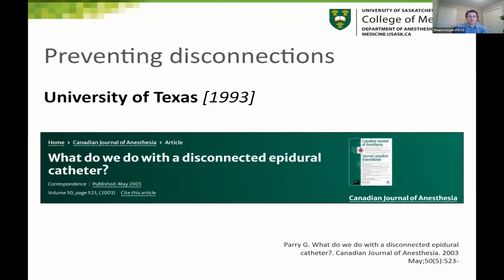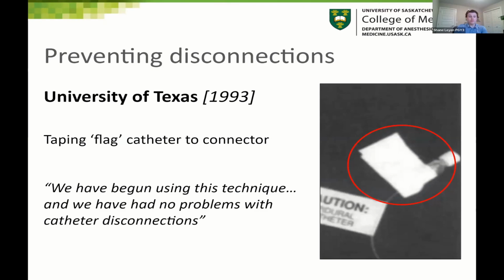This is out of Texas, but published in the CJA, and something a lot of us have probably heard of is simply taping the flag to the connector. They did not give stats, but they said since we began using this technique, we have had no problems with epidural disconnections.